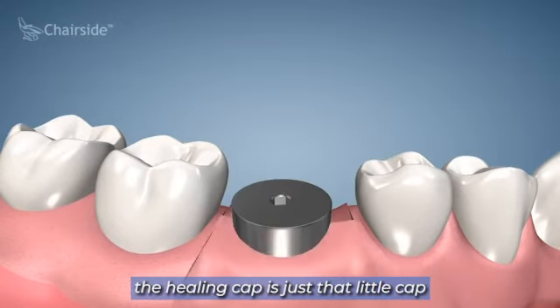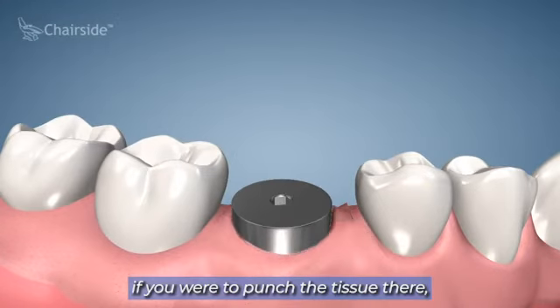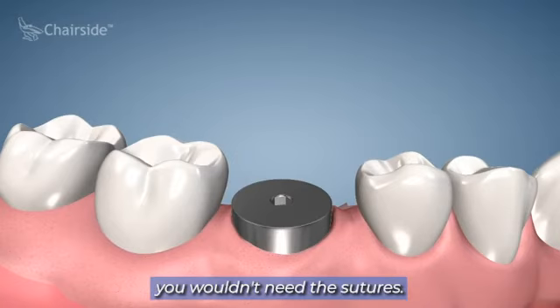Now they're placing a healing cap — that's just the little cap that goes on there. You do want to brush that cap. They're also showing some sutures being placed, but again, if you were to punch the tissue you wouldn't need the sutures.